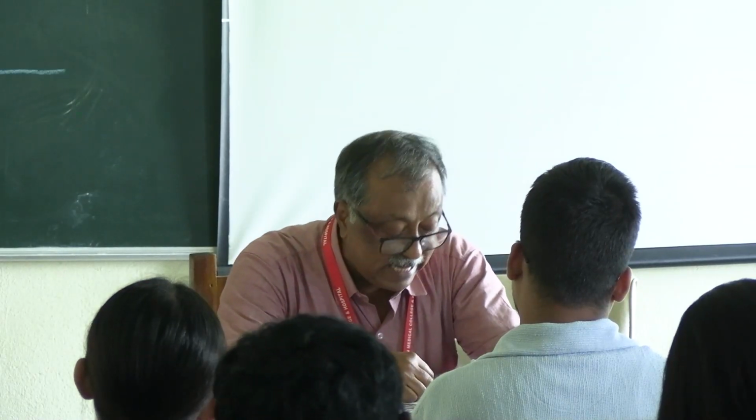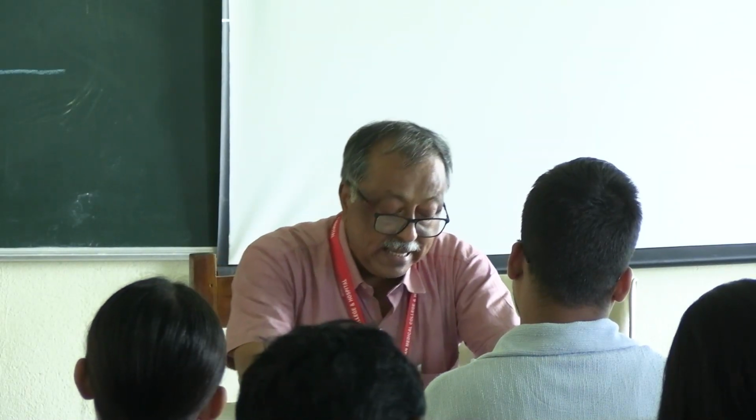But in the Gellé test, hearing positive means that the hearing is reduced.